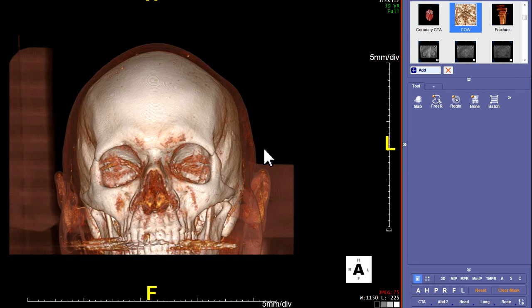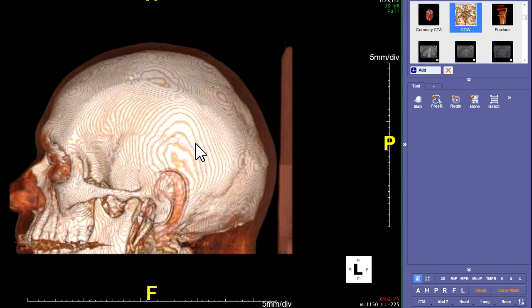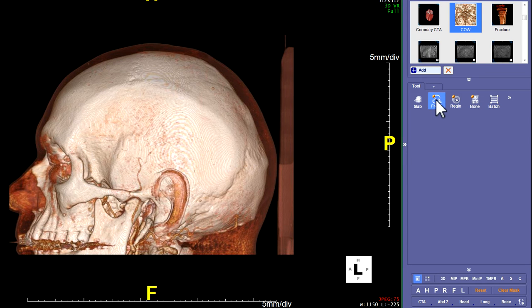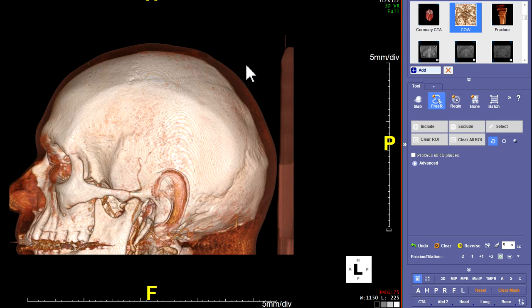The first thing we're going to do is make the 3D COW with the bone on, and then we'll make the other ones out of that. So we'll start with 3D COW with bone. Go to the left lateral view. We're going to cut off the head, so go over to where it says Free ROI Tool. Click that and we're going to do some cuts.